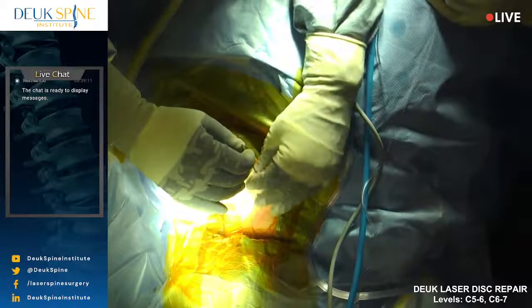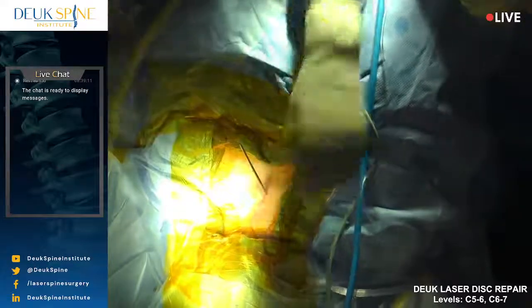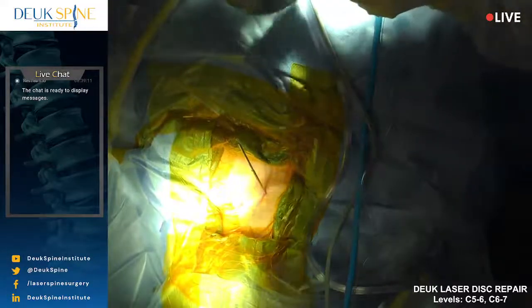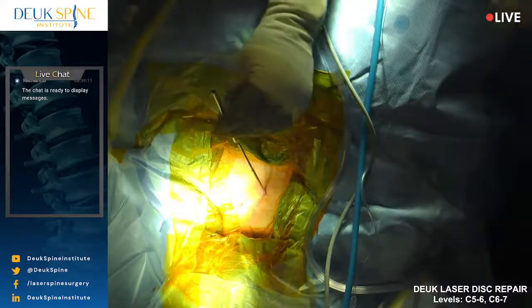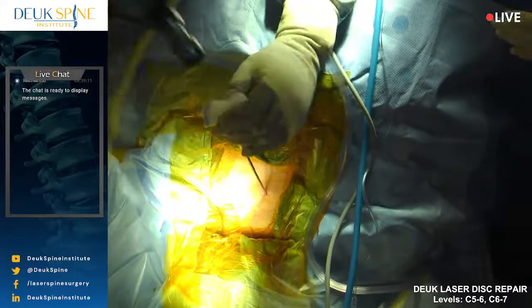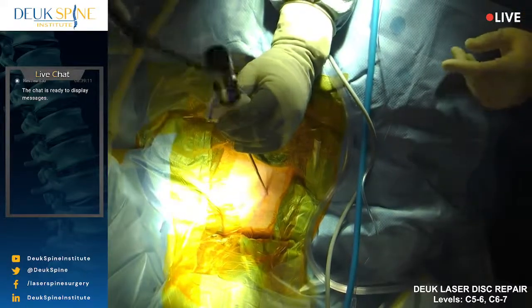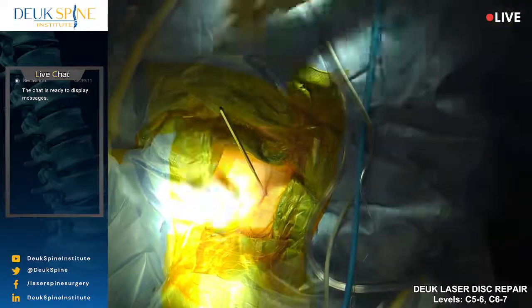Now, this surgery isn't for everyone to do. Not every spine surgeon will be able to do this surgery. It takes tremendous amount of skill and experience, and it's not like you can learn it on a weekend course. So eventually this is what will be done for all herniated discs, bulging discs that are symptomatic, all degenerated discs as well. All right, so I'm going to need another lateral view.